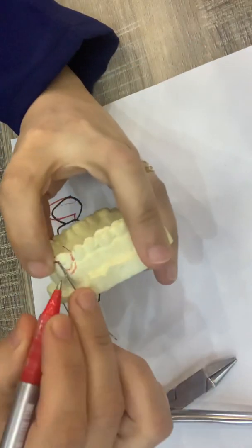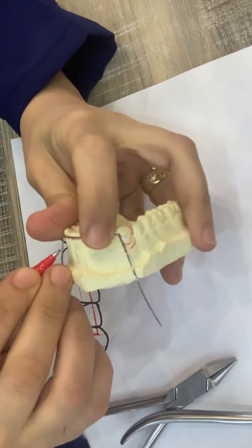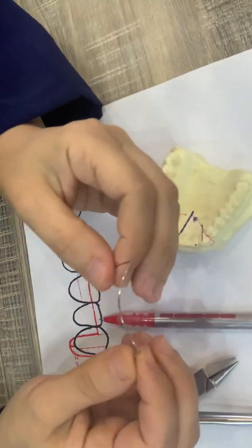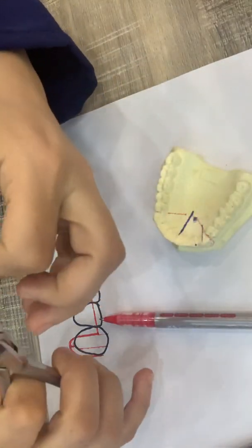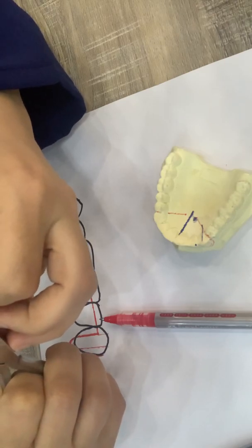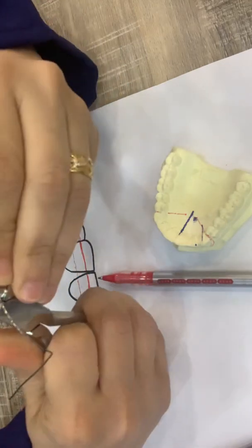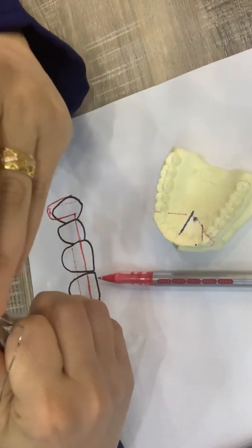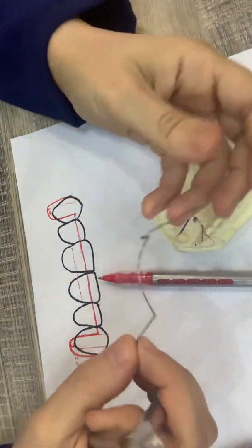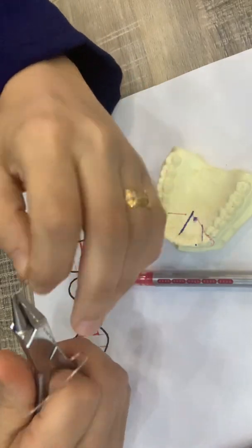Now we mark the U-loop, as we said, should be 2 mm from the gingival margin of the canine. The other side also.